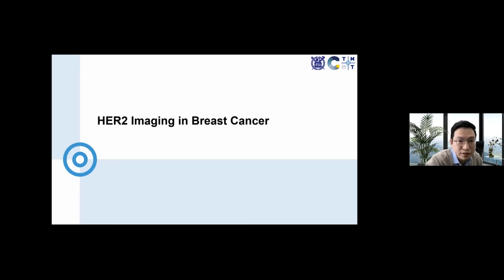So there's another question. The axillary lymph node is higher. Yeah, I've seen that in a lot of cases actually, but I don't have a clear answer for that. I'm not sure why that is the case in breast cancer.